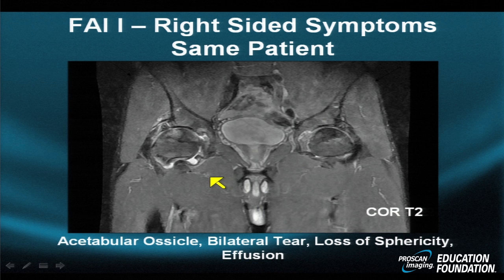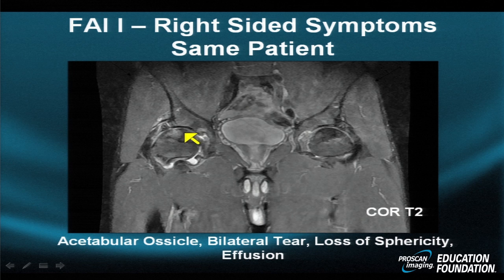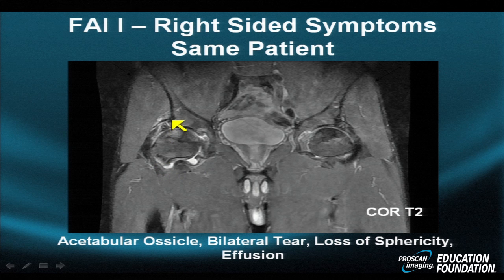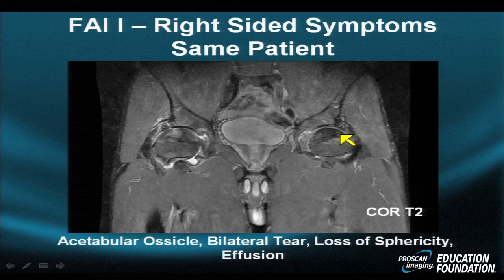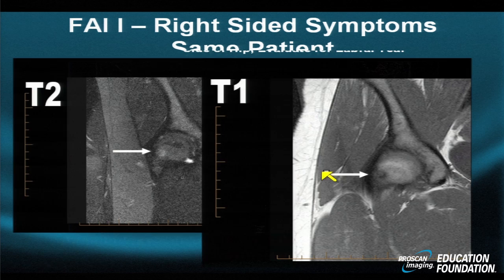There's an erosion of the femoral head that demonstrates a stress reaction. The capsule is swollen, floppy, and distended. The supralateral capsule is swollen with a small cyst forming along its lateral margin. On the contralateral asymptomatic side, the same findings are evolving, including a small extra-articular paralabral pseudocyst.